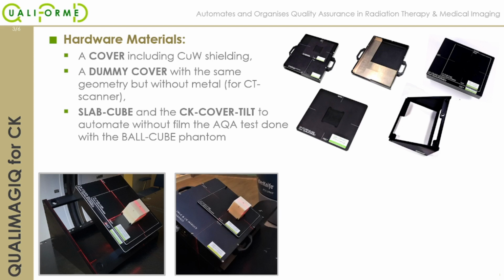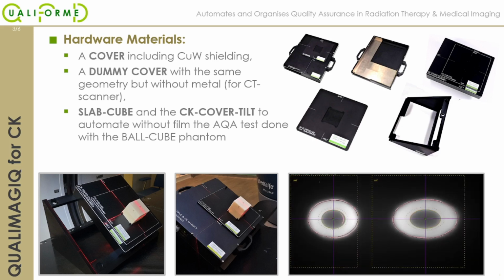The only difference is the real cover with the CK imager inside and the ball cube phantom equipped with its metal ball. Here you can see the image we obtained. In a single image, we can see the anterior and the lateral beams.